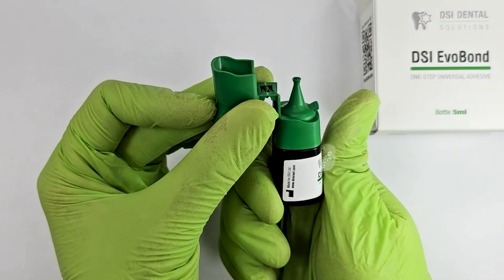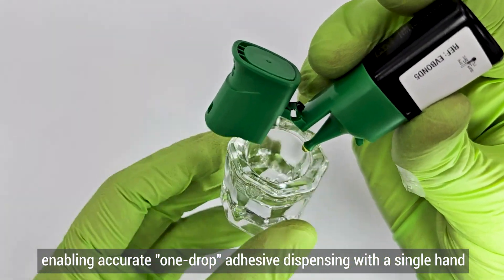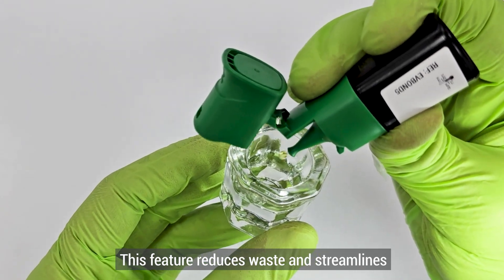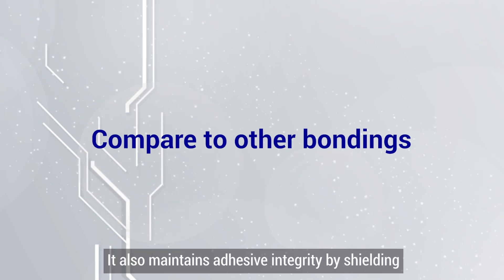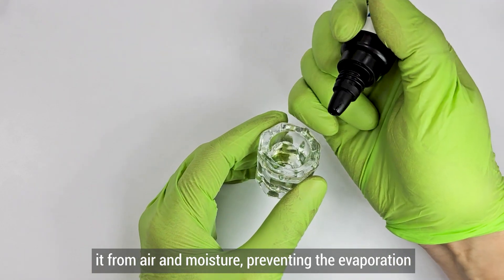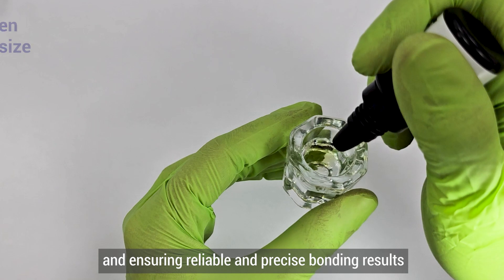EvoBond features a new improved flip-top cap design enabling accurate one-drop adhesive dispensing with a single hand. This feature reduces waste and streamlines the clinical workflow, ensuring smooth application. It also maintains adhesive integrity by shielding it from air and moisture, preventing evaporation and ensuring reliable and precise bonding results.